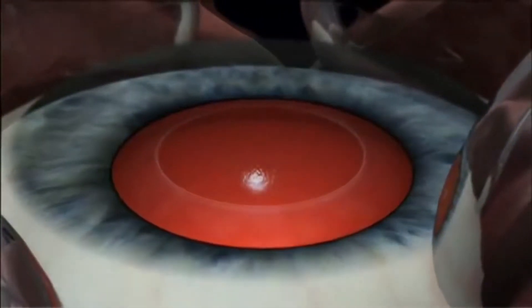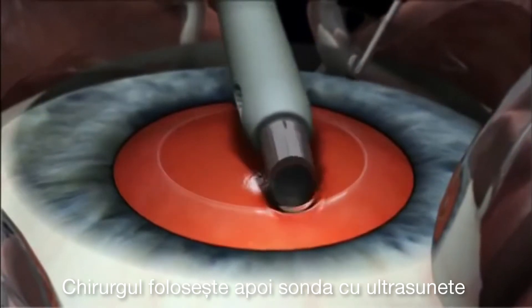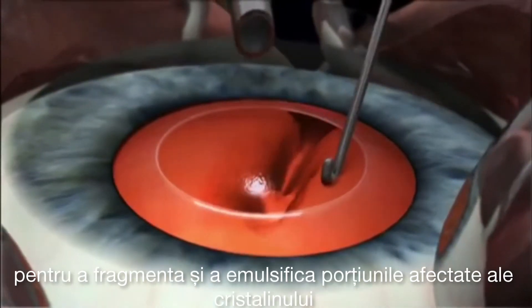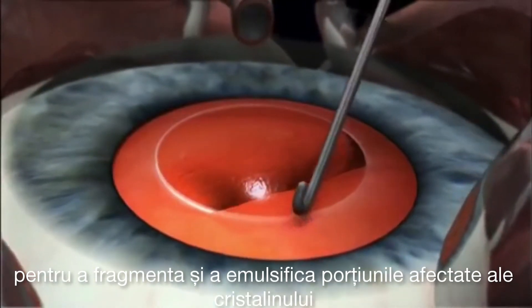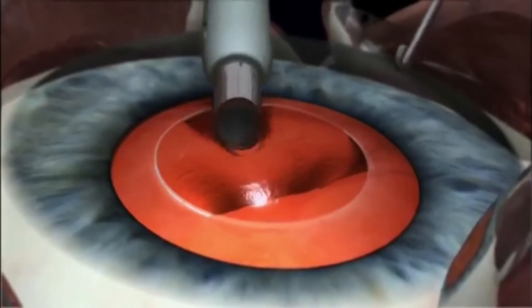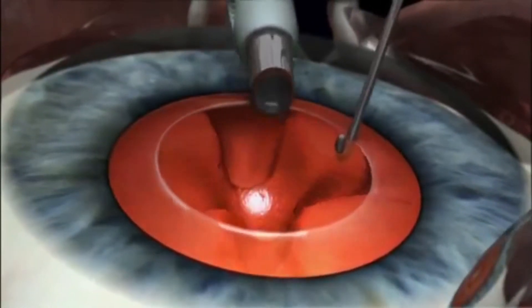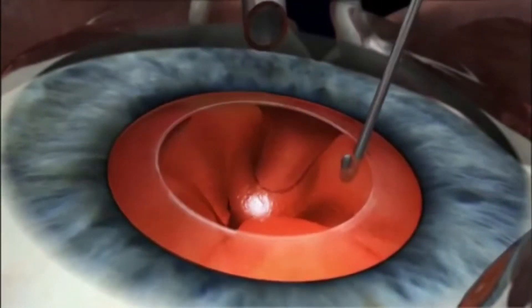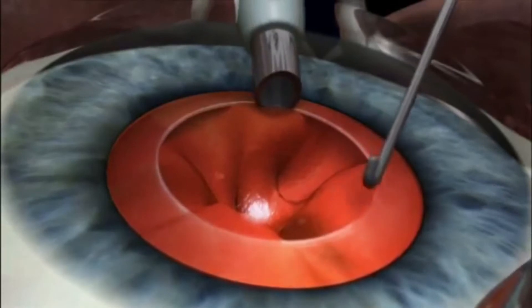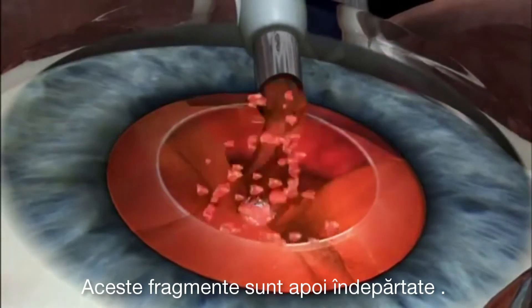The surgeon then uses ultrasonic waves to fragment and emulsify the clouded portions of the lens. They are then removed.